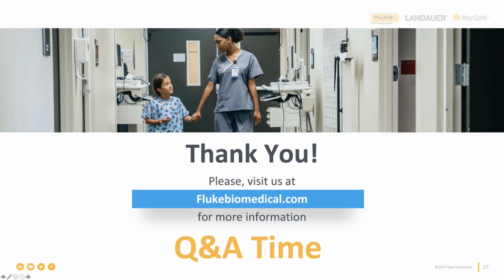The next one is NIBP related, which is, will the size of the NIBP cuff play a big role on the accuracy of the result of the NIBP? I would say that the placement of the cuff plays a bigger role in the accuracy. Michael, if you would like to add anything to it. Well, also just using the right cuff for the right application is important, because you do have some for pediatric applications and some for adult.